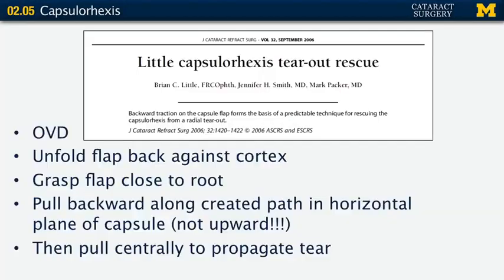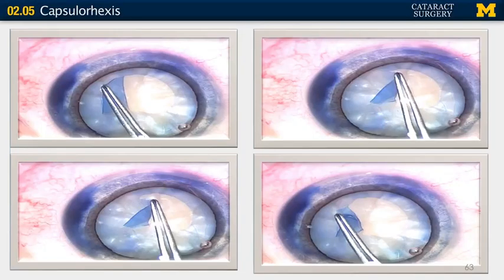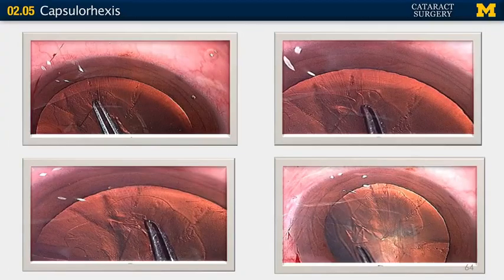It's still stressful — these excellent pictures from Dr. Little's paper illustrate the tear-out rescue next to a white cataract with the capsule stained with trypan blue. Feeling a little too close to the periphery, you take the flap, lay it back down where it originated, pull backward, then pull centrally. It clearly brings the tear inward. The same technique done against the red reflex shows the tear way out in the periphery — pull back, then pull down toward center — and it clearly brings the tear back inward.